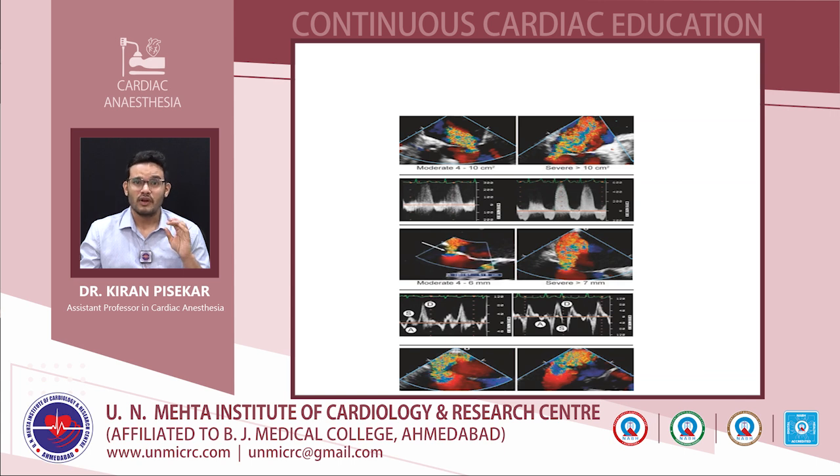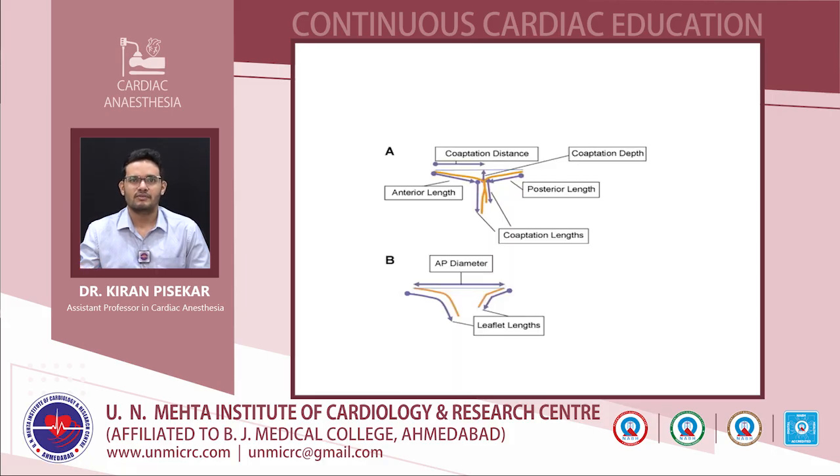So by using these different methods, we can assess the severity of MR. And this is showing the pulmonary vein waveform. So in severe MR, we have systolic flow reversal, which can help in the assessment of MR.